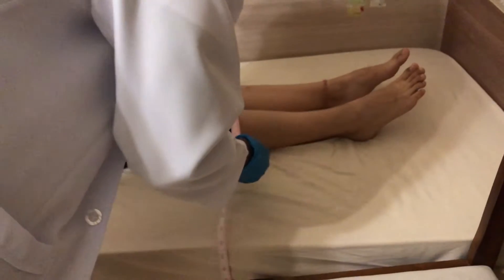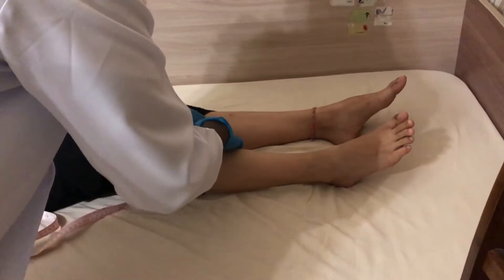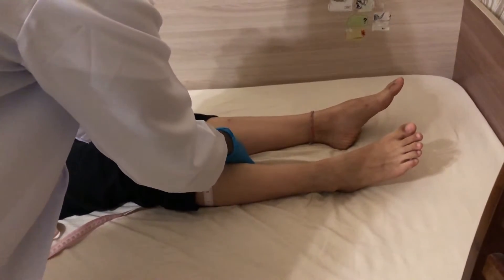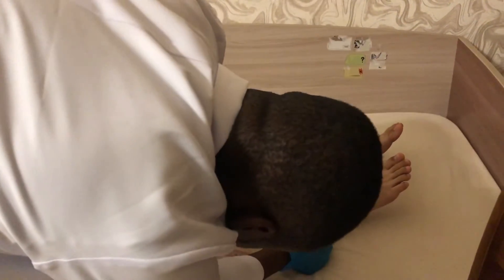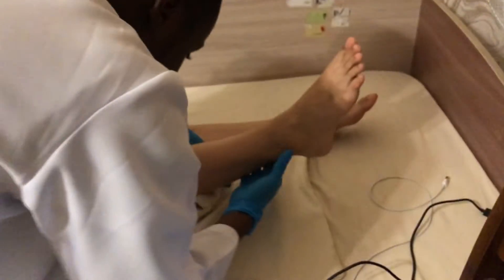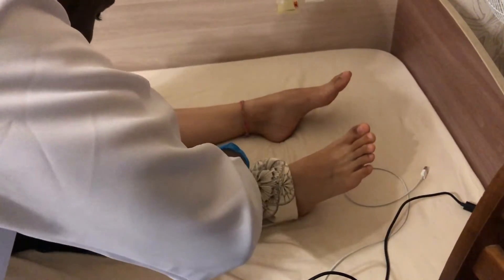Let me measure the widest part. Sorry, this is going to be a bit uncomfortable. Once I get my device — I don't have the actual device so I made a makeshift one — you put it underneath the patient's leg gently and then attach it with the velcro. In this situation we are going to tuck it underneath the leg.